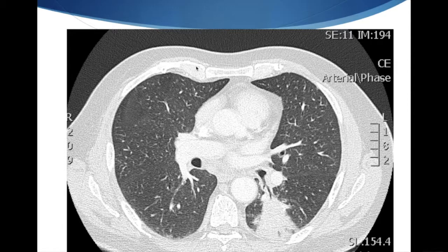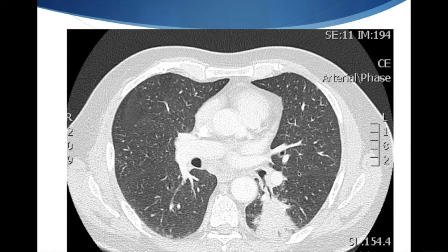To orientate you, this is the front here with the sternum, this is the back with the vertebra, and the lungs are in here. This is the heart in the middle and this is the left lung. Now this white area of abnormality here is the abnormal lung mass. You can see here that there's an airway leading into that.